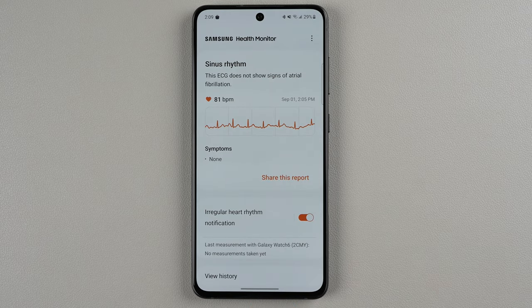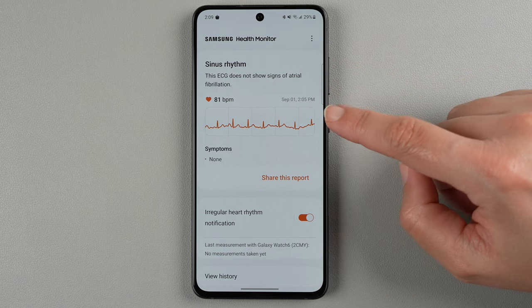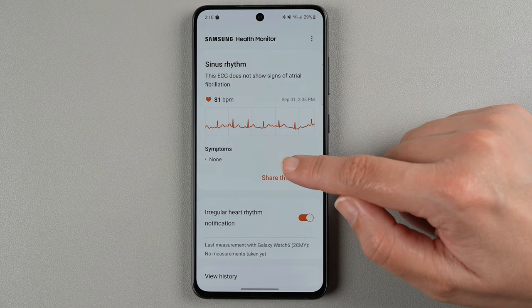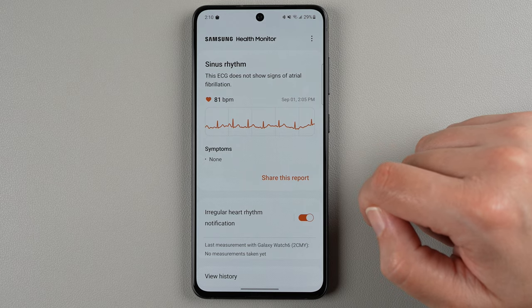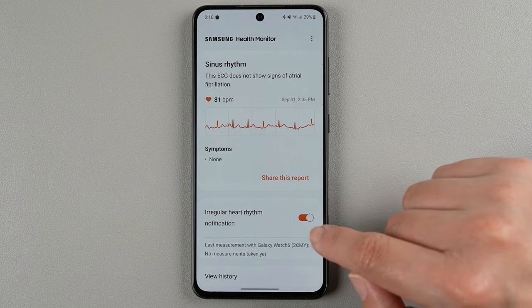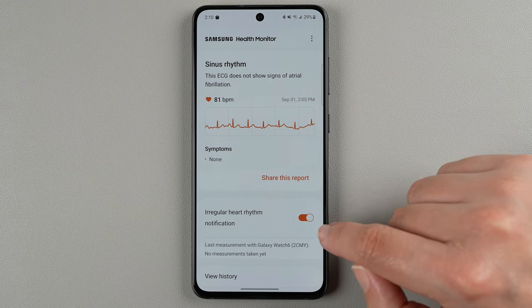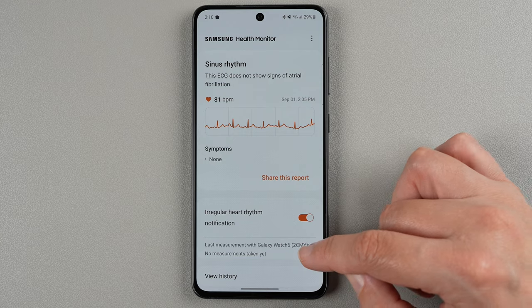Now we're back into the ECG result that I just took. Again, it's saying this is the sinus rhythm — this ECG does not show signs of atrial fibrillation. It gives me my average heart rate, the date and time, and any symptoms that I added, which I did not have any. You can tap here to share this report. Down here is also where we have the irregular heart rhythm notification, and we can turn that on or off. It looks like it will give you a history of the measurements it takes in the background.